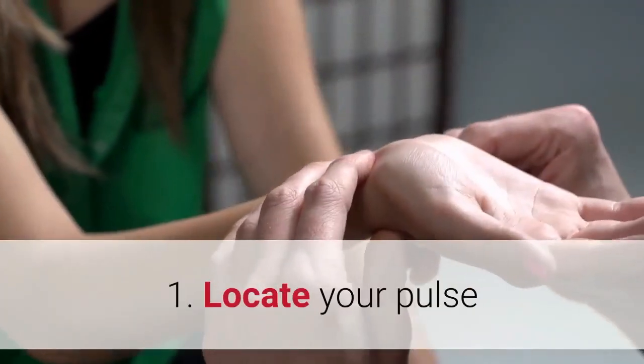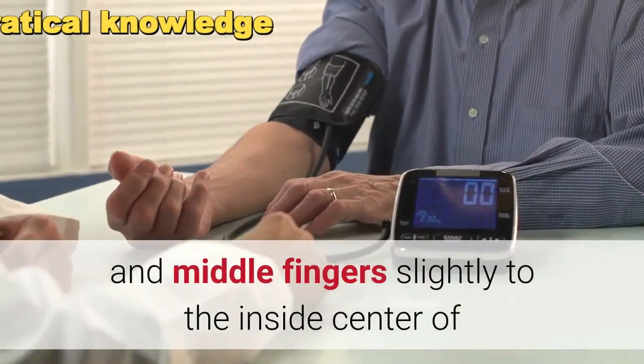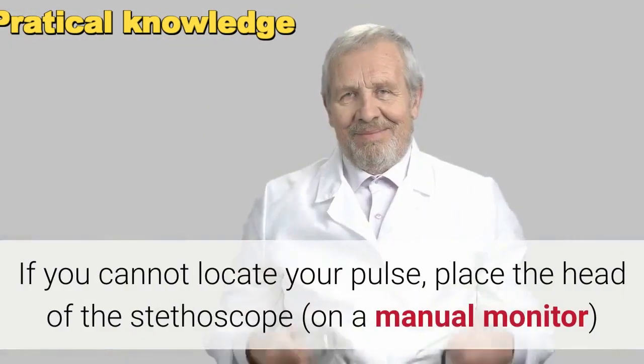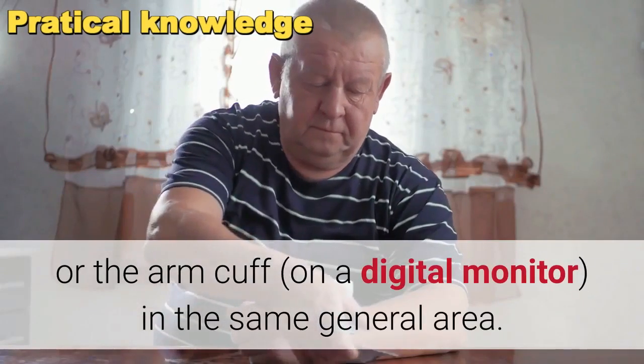Step one: locate your pulse. Locate your pulse by lightly pressing your index and middle fingers slightly to the inside center of the bend of your elbow, where the brachial artery is. If you cannot locate your pulse, place the head of the stethoscope on a manual monitor, or the arm cuff on a digital monitor, in the same general area.